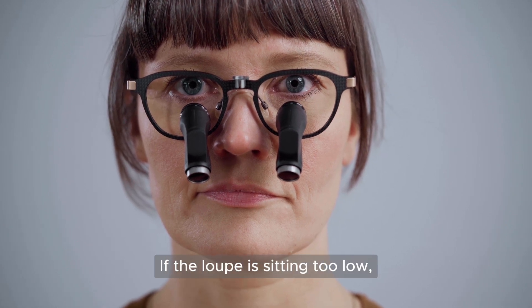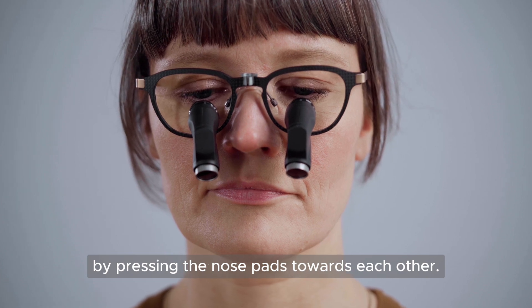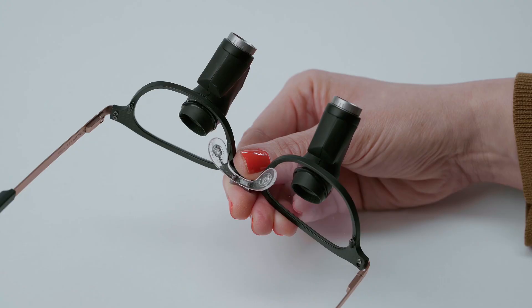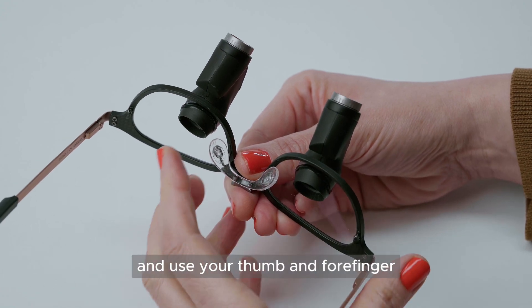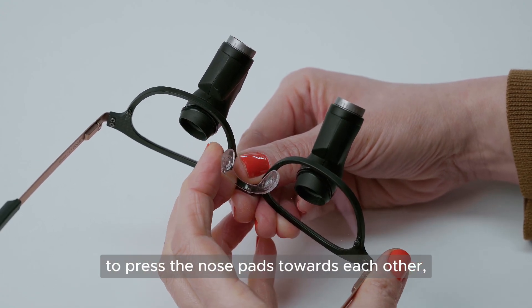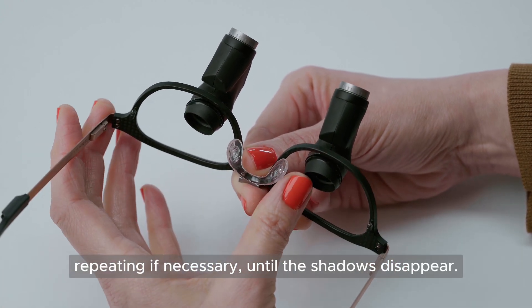If the loupe is sitting too low, you can move the loupe up by pressing the nose pads towards each other. Hold the frame at the nose bridge, and use your thumb and forefinger to press the nose pads towards each other, repeating if necessary until the shadows disappear.